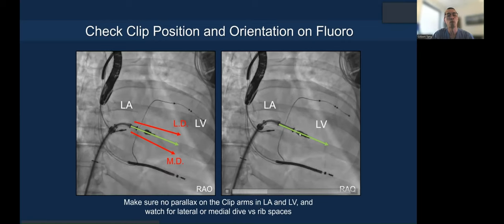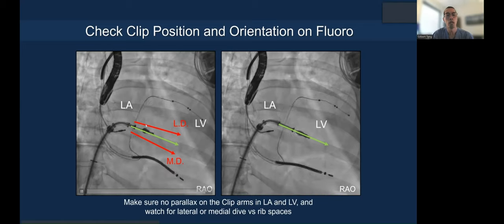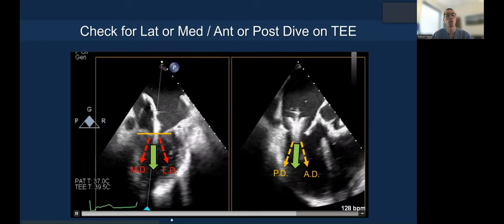The parallax must be removed. On 3D en-face echo you already know you're at the optimal orientation, so on fluoroscopy — because it's higher resolution — you can then confirm the clip has not spun. This has also been described in the SKY eBook.